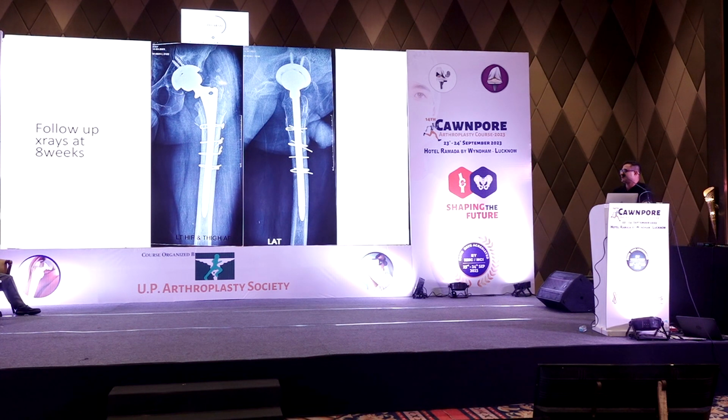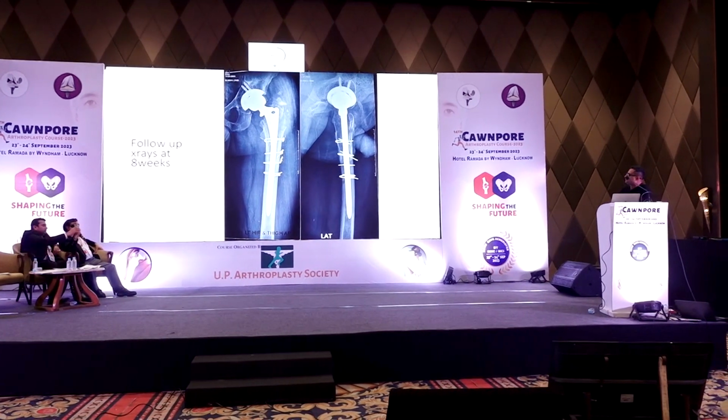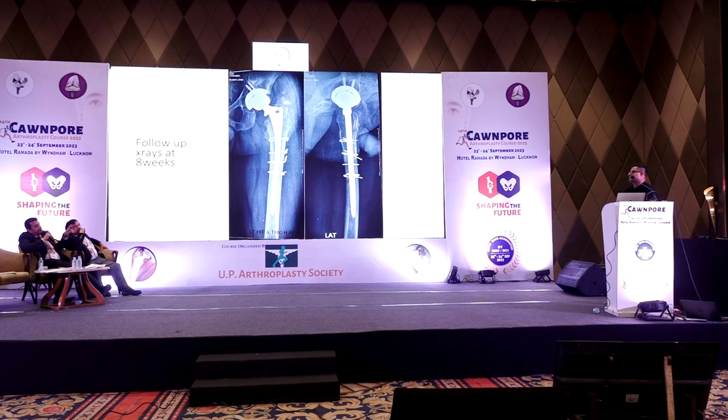Sir, I don't know the previous gait of the patient before the surgery. I had not revised the cup, so the version which was checked on table. No, I think the socket is falling into retroversion, and that patient is compensating for that by external rotation. You can see from this X-ray that this cup appears retroverted from the AP view. I totally agree. That is why he's compensating by externally rotating, otherwise it would dislocate posteriorly.